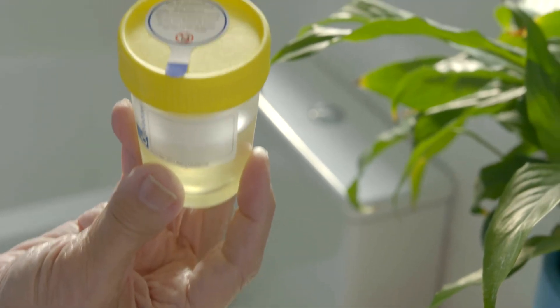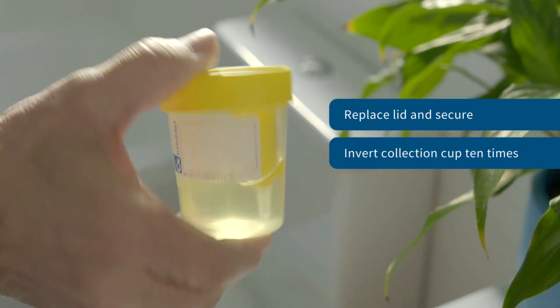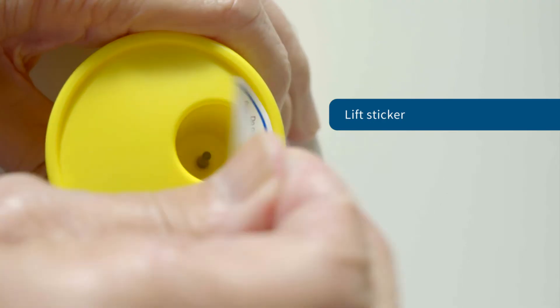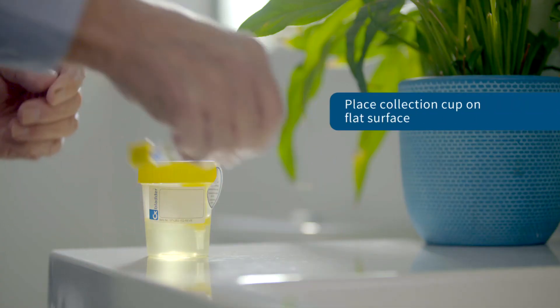When completed, ensure that the lid is replaced on the collection cup and secured tightly. Immediately invert the collection cup gently 10 times, then peel back the sticker on the top of the cup. Be aware that there is a rubber-covered needle under the sticker on top of the cup, so please use caution. Place the collection cup on a level hard surface.